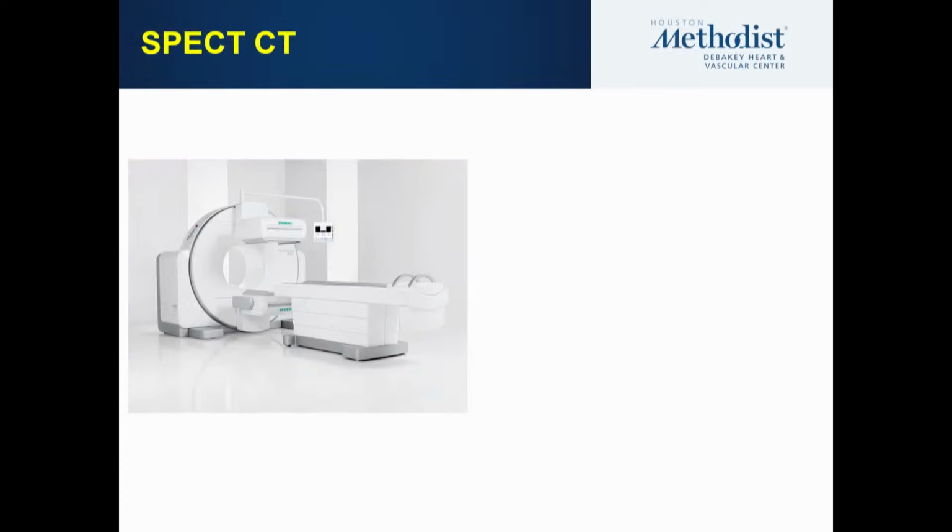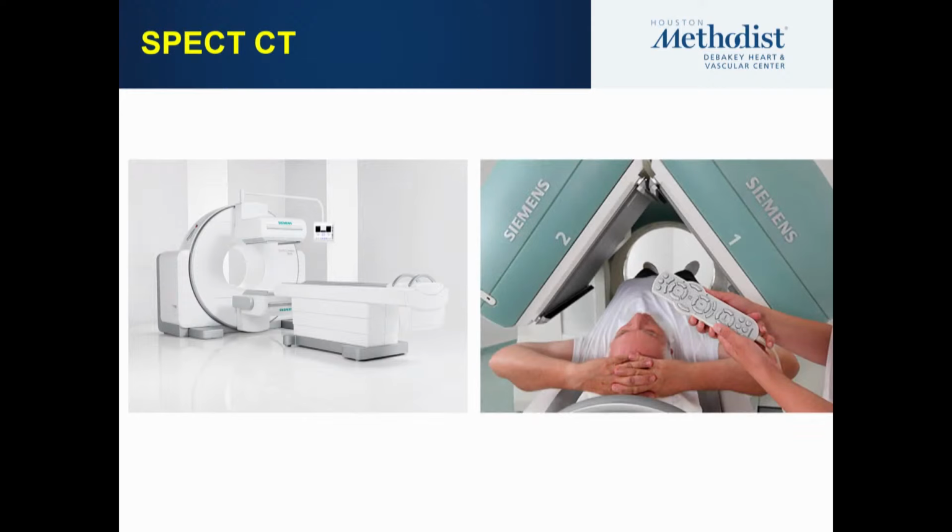Is this a PET scanner that you see here or no? These two are PET scanners or no? Yes or no? Well, the title says SPECT CT, so it is a SPECT scanner.